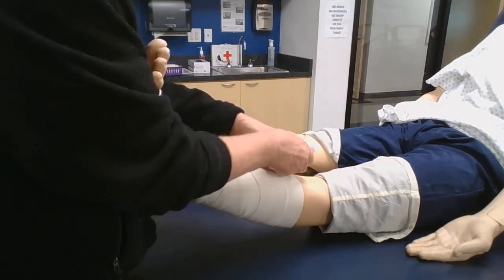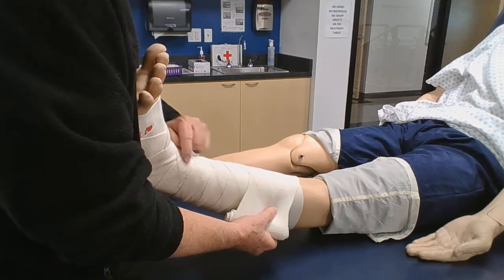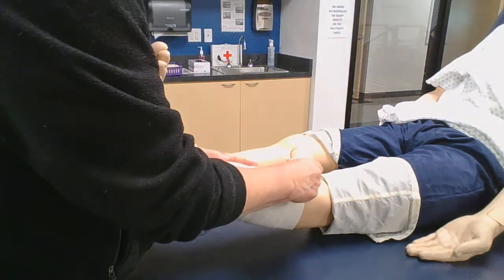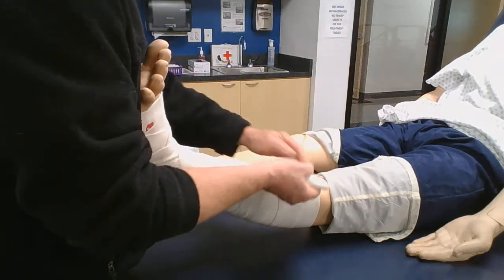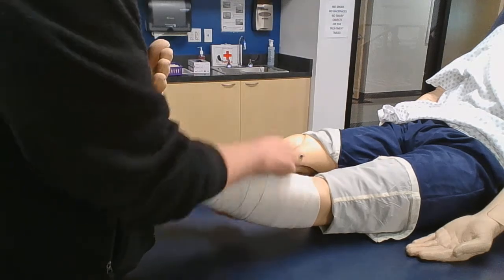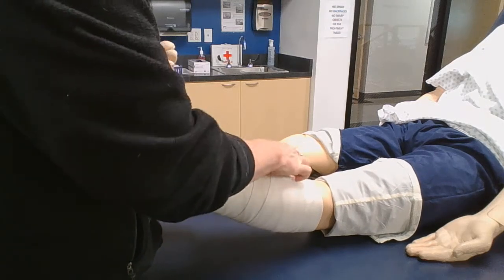It's like a handoff behind the lower extremity. Okay, I'm following that pattern, trying to keep the same width all the way. Down and up again, around and down. Okay, keeping that. We have to be really consistent with that, you guys. Okay, and then up again. Okay, so we didn't get into the popliteal area at all.